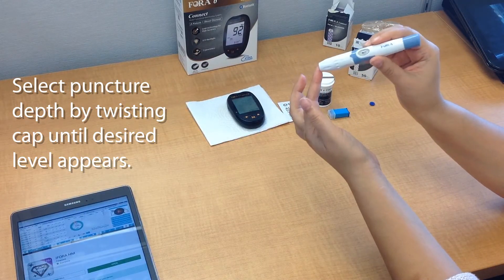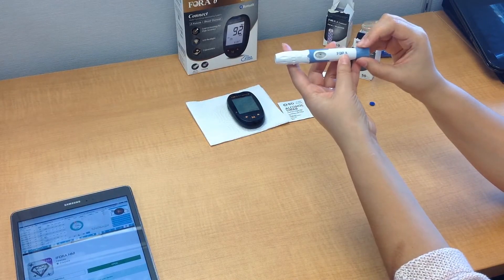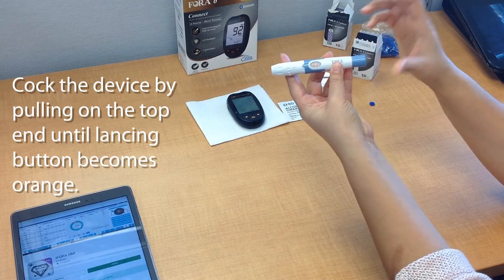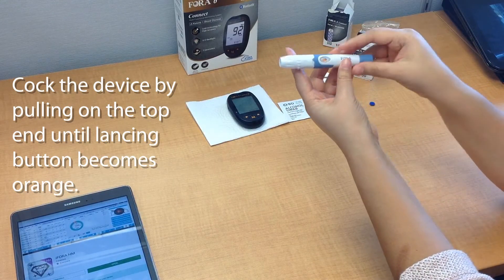The larger the amount, the more blood will come out from the puncture site once you do that. Next, we're going to go ahead and cock the device by pulling on the tip like this. You'll notice that the puncture button is actually orange now — that means that it's ready to go.